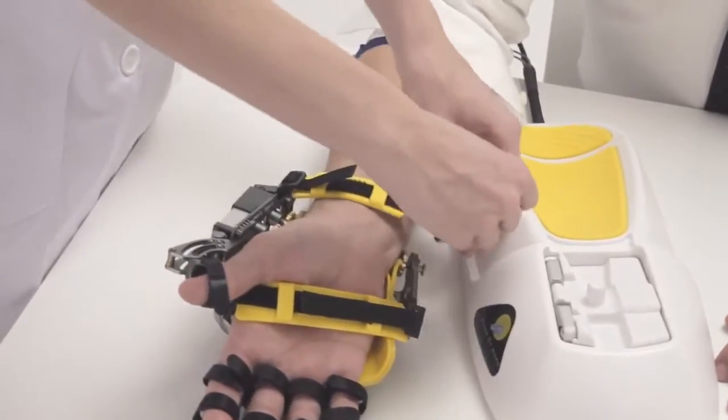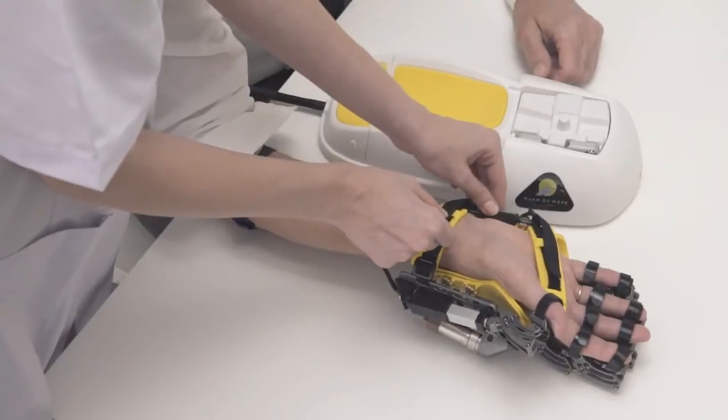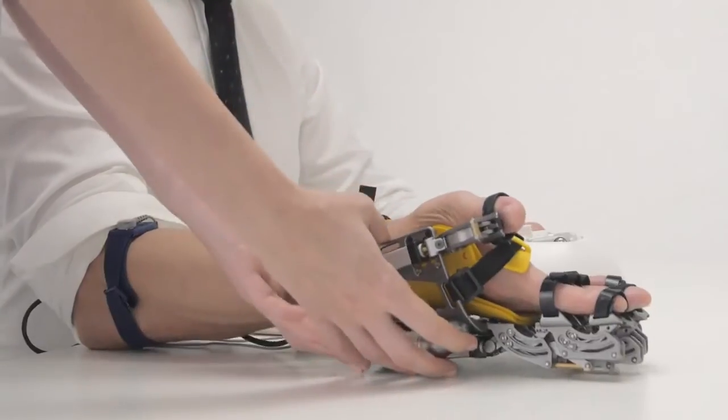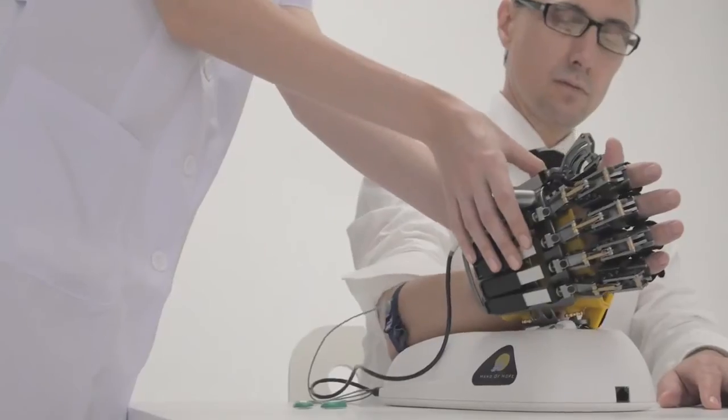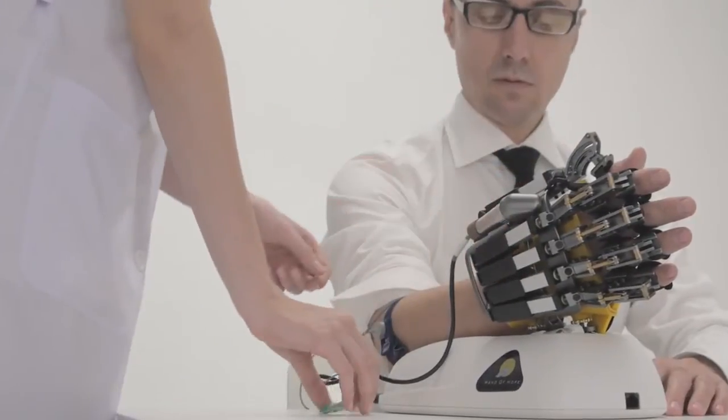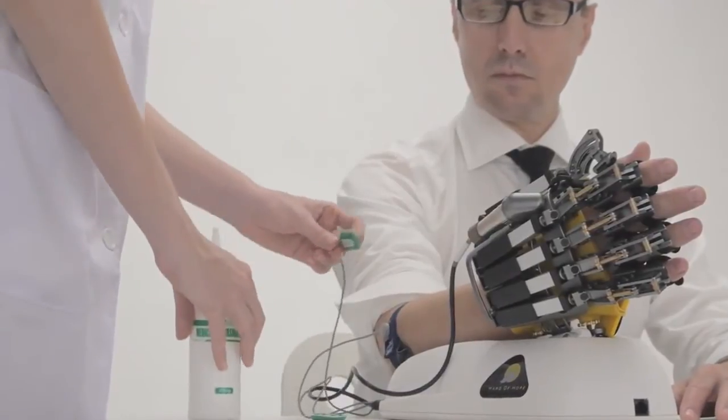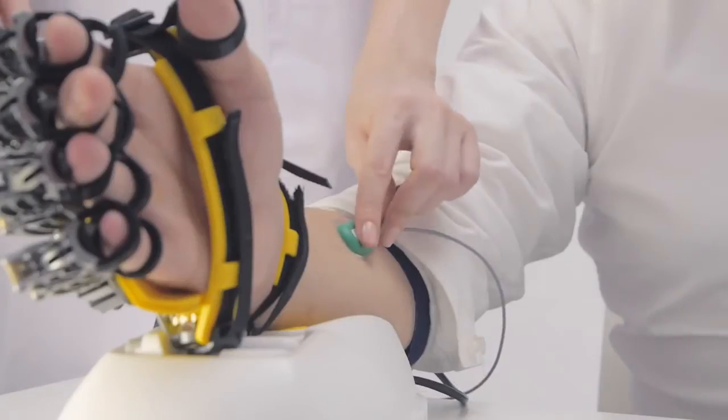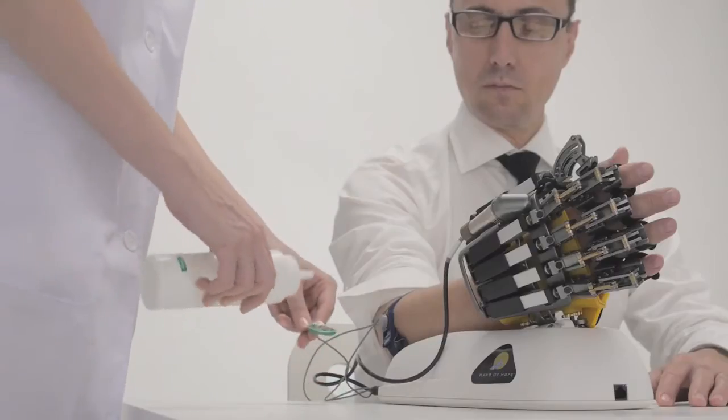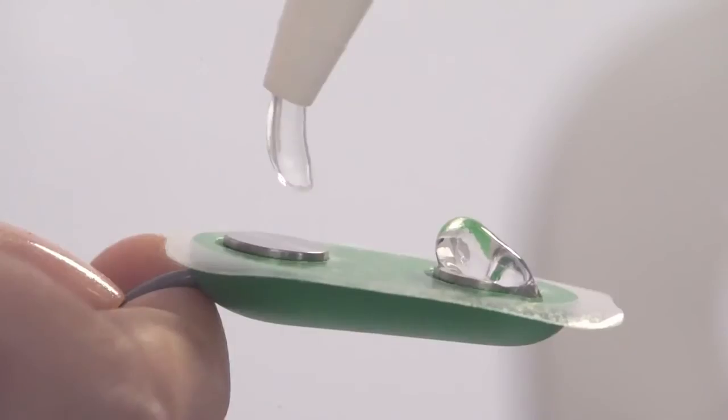Hand of Hope is relatively easy and quick to set up by following simple instructions. Rehab Robotics and Hong Kong Polytechnic University work together to develop it. The effectiveness of this patented technology is proven by clinical trials and published research papers.